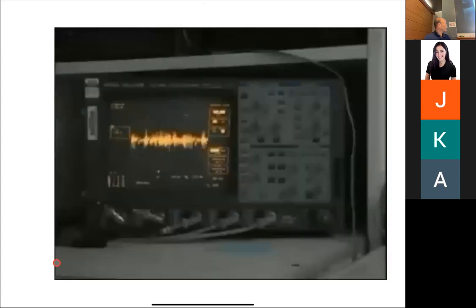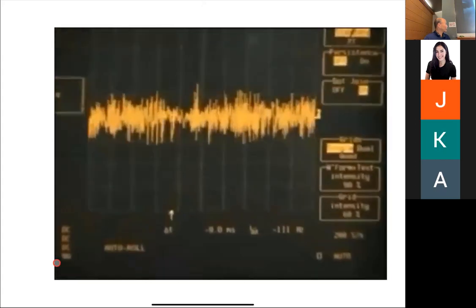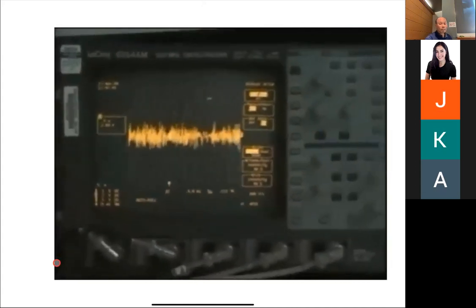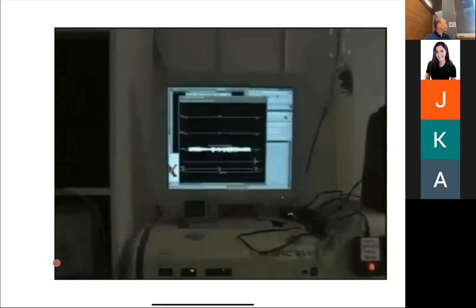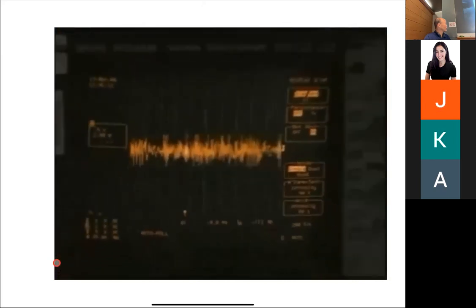Only a few lines of pulse program code are necessary to output the array to the gradient waveform controller. Shown here on the oscilloscope is an example of the current output of the gradient amplifier of the digitized bagpipe sound file. Here's a view of the Bruker ParaVision pulse programming tool showing the 32 kilobyte digitized waveform of the Scottish bagpipes played out on the slice selection gradient.